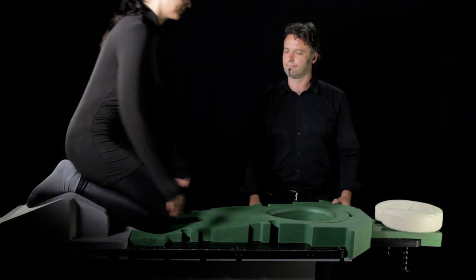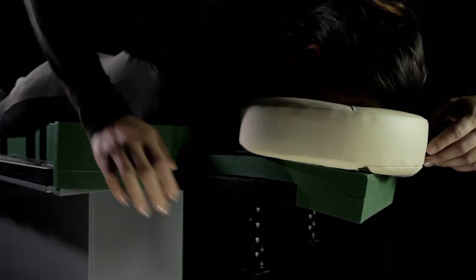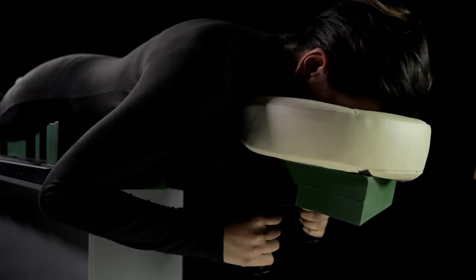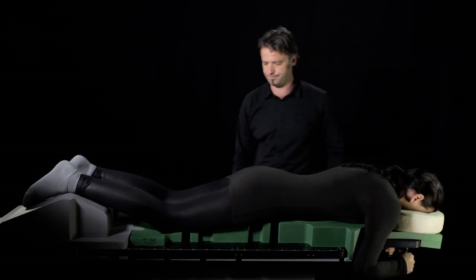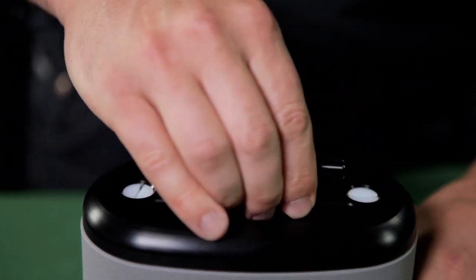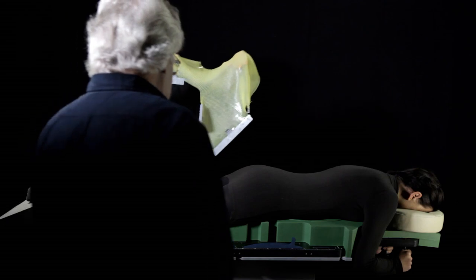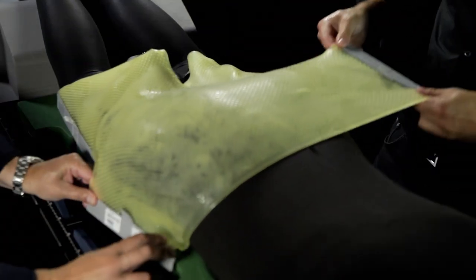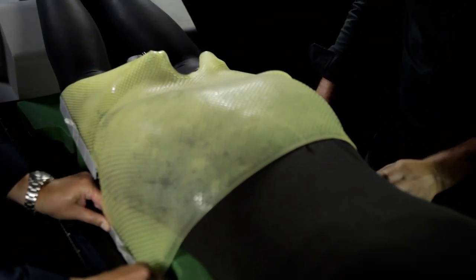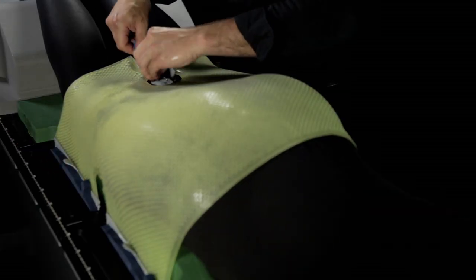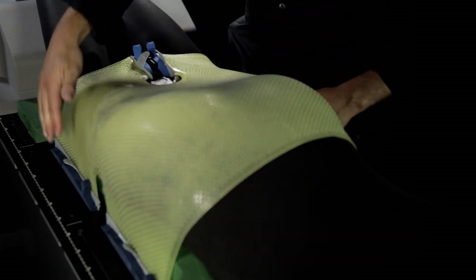The patient can now be positioned on the AIO belly board. Adjust the patient's position until he or she is lying stable on the cushion. And then make sure that the lower part of the patient's abdomen is lying against the caudal edge of the belly insert. When the leg separator is in position, the six-point pelvic cast mask can be applied to the patient. Stretch a warmed, pre-cut mask over the patient's pelvic region and insert the clips into the correct openings in the base plate. Fix the clips into the slots using the blue EVA blocks.